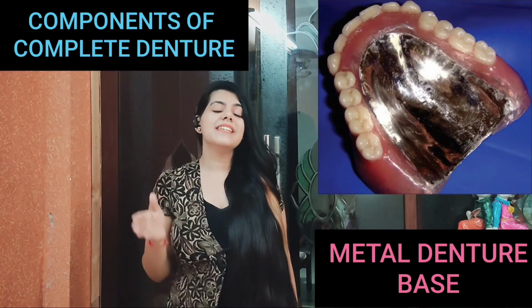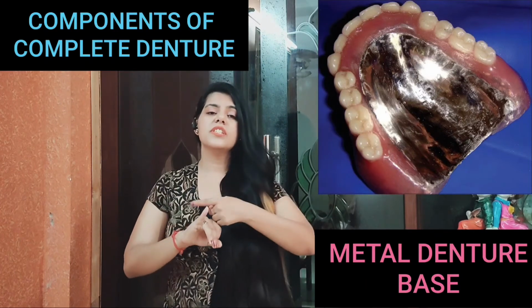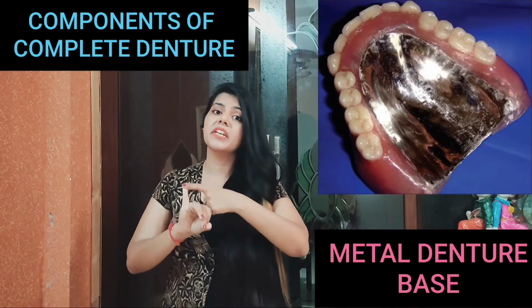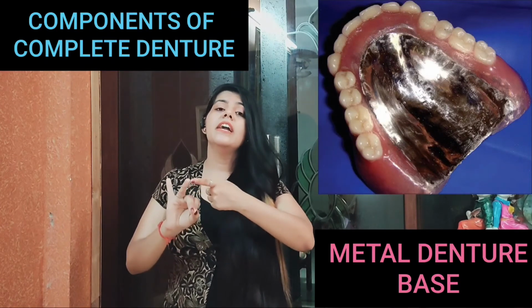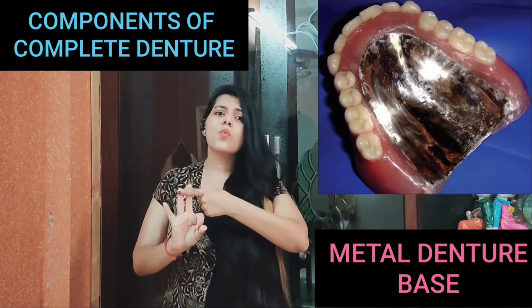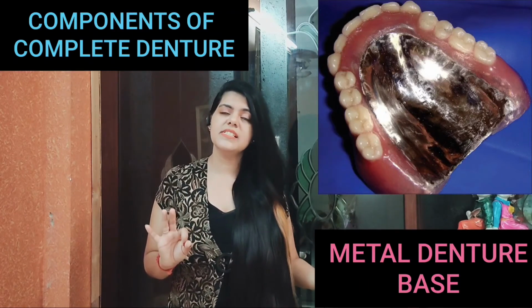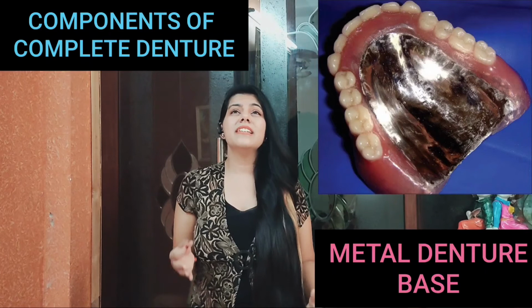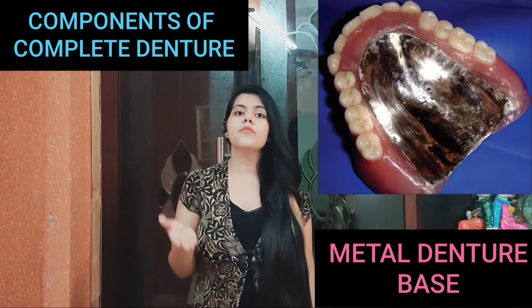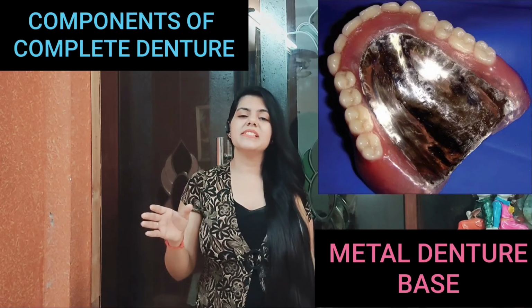Now come to the disadvantages of the metal denture base. The first disadvantage is it requires more time for fabrication, यानी कि इसे बनने में बहुत टाइम लगता है. It requires the refractory cast material. Third, it is quite expensive as compared to the acrylic denture base. Another disadvantage is that it cannot be easily rebased and it is difficult to fabricate as compared to the acrylic denture base.